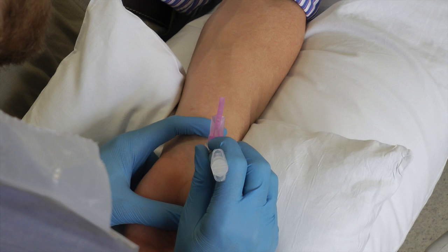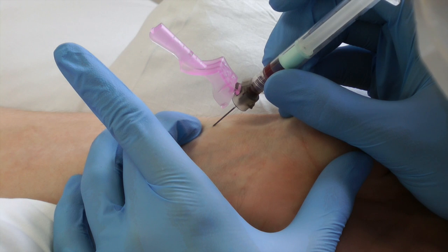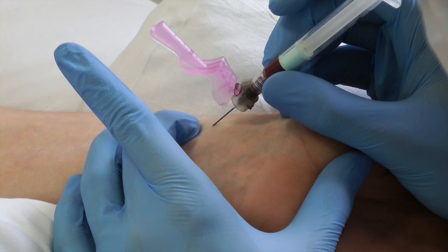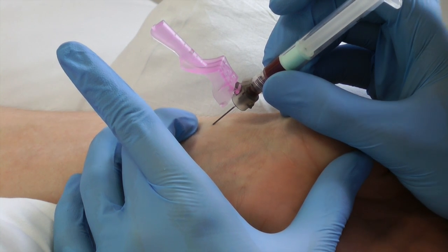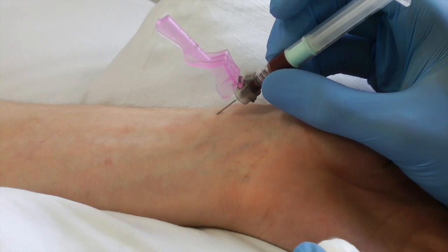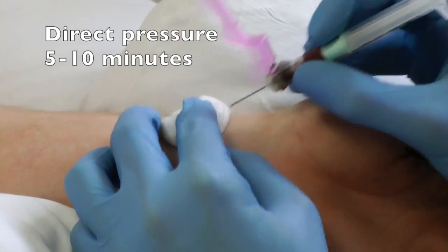Hold the needle perfectly still while the syringe fills with blood. The arterial pressure will fill the syringe with blood without the need to aspirate. Once you have an adequate supply, remove the needle quickly and apply direct pressure with a cotton bud.